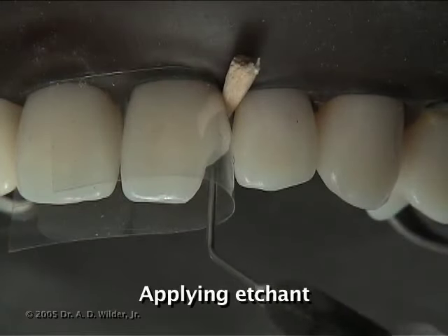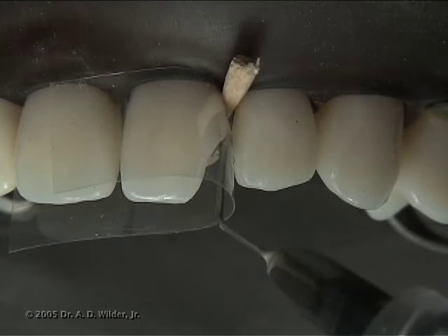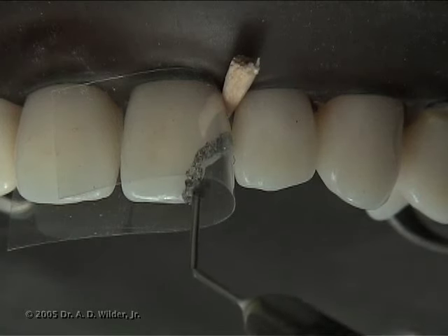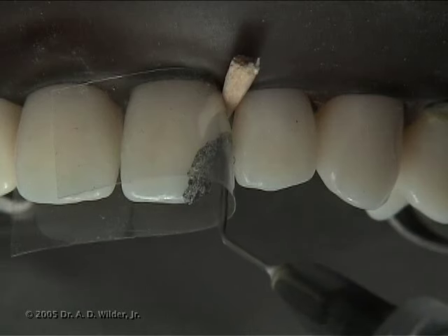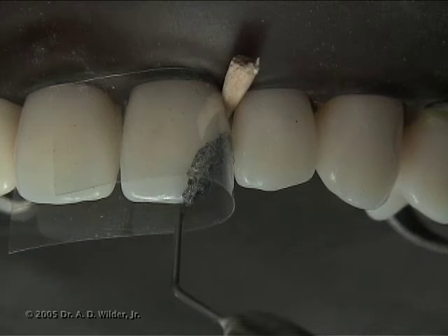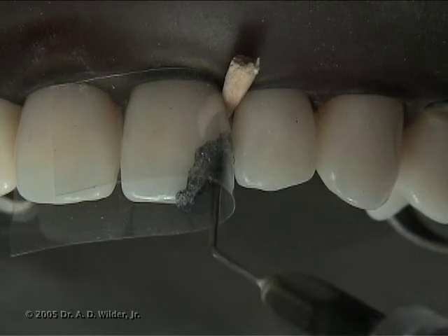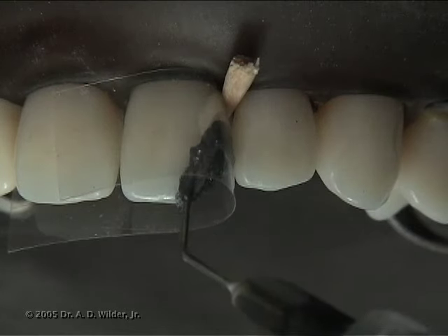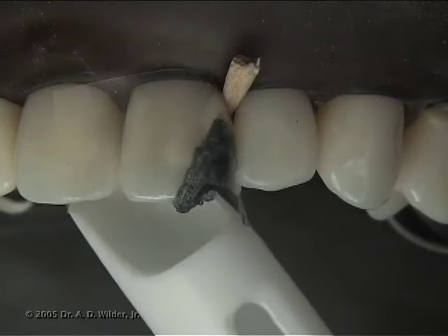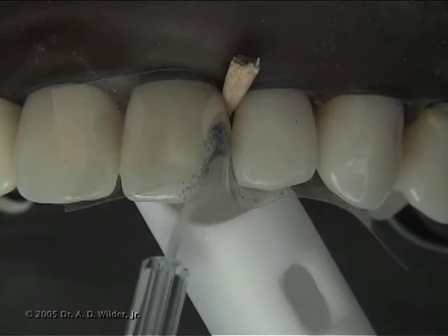Apply 30-40% phosphoric acid etch to the entire preparation to clean off surface debris and remove the smear layer of dentin, taking special care to make sure that the beveled enamel is also etched. Let it sit for about 15-20 seconds and then wash it off thoroughly with water and high volume suction, rinsing for about 10 seconds.